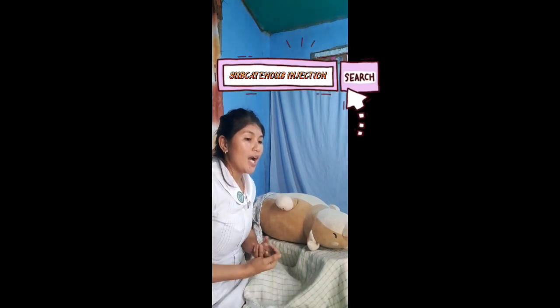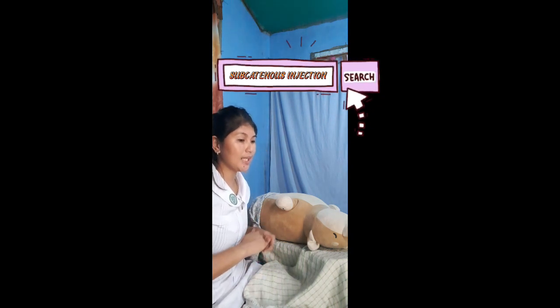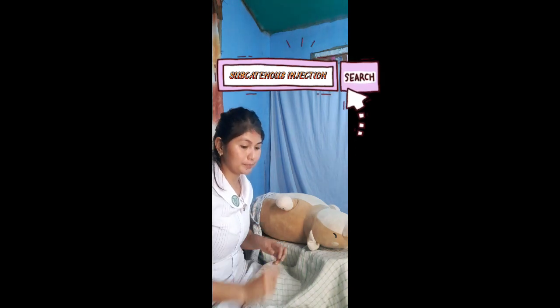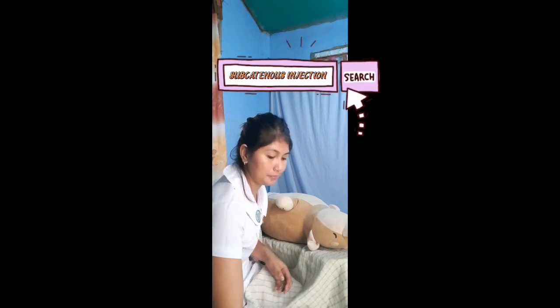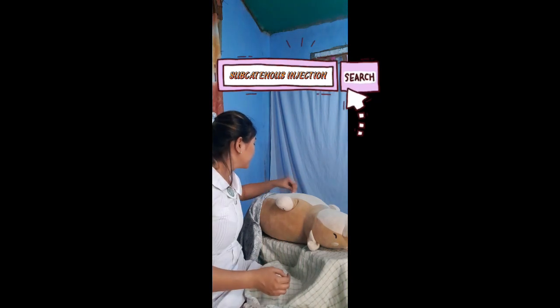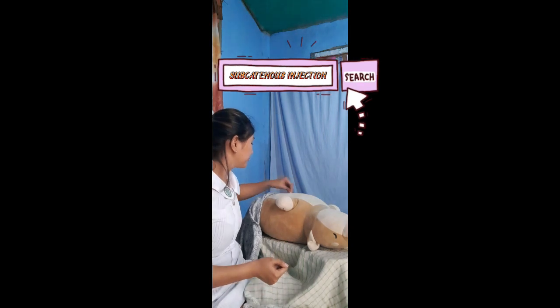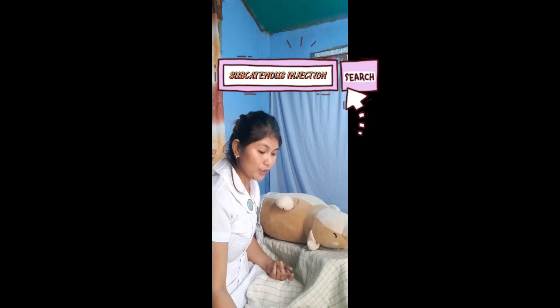Now I use an aseptic swab to clean the site, beginning at the center and moving outward in circular motions about 5 centimeters. Next, remove the cap of the syringe.